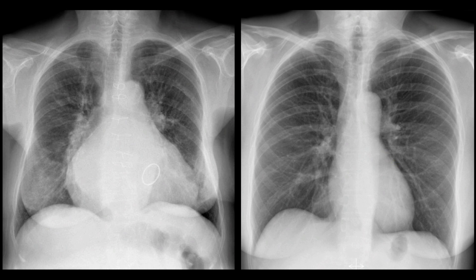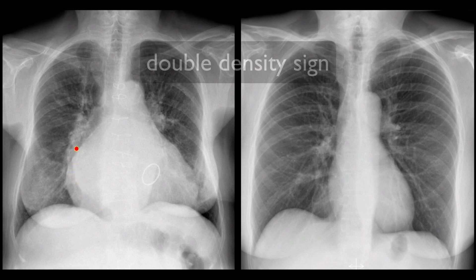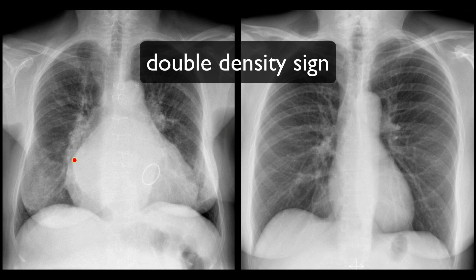However, when the atrium becomes enlarged, its right aspect may become directly visible as an extra shadow paralleling the right heart border. This is known as the double density sign, or the double right heart border sign of left atrial enlargement.